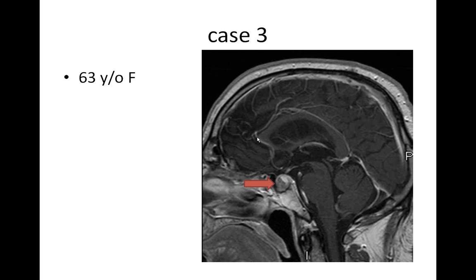It's kind of a nice view here because actually not only can you see the cerebrum, you can see the corpus callosum here. You can see this is the cerebellum. This is the midbrain, this is the pons, this is the medulla, and this is the spinal cord. Now this tumor, 99 times out of 100, when it looks like this, in this kind of a setting, it's going to be a benign tumor of the pituitary called the pituitary adenoma.